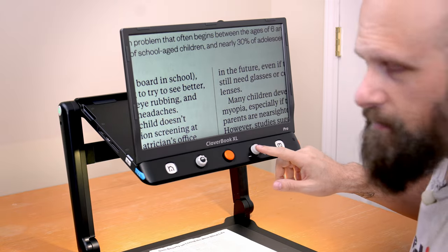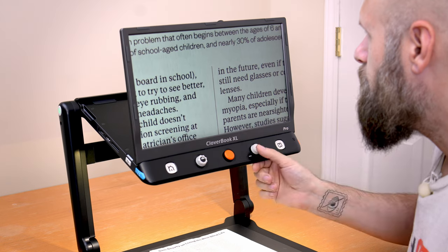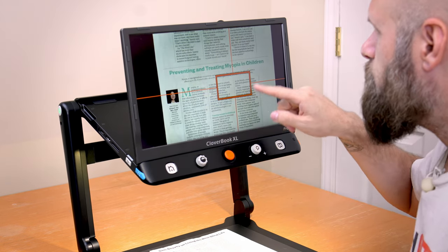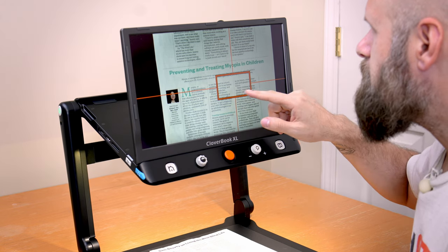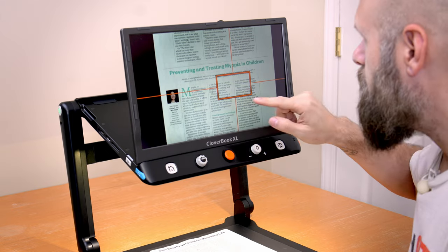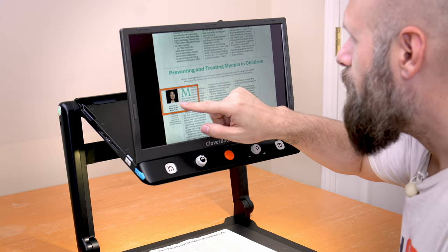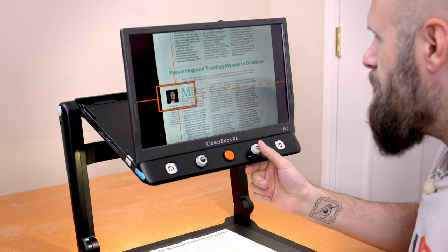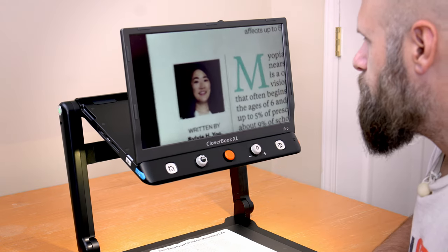While magnified in, if I want to quickly jump to a new area, there's a much easier way than using the joystick. If I tap the button on the magnifying dial, it activates Locate — it zooms out and gives me a crosshair with a box representing the magnified area. I drag that box to a new spot, tap the button again, and it jumps me right to that area.